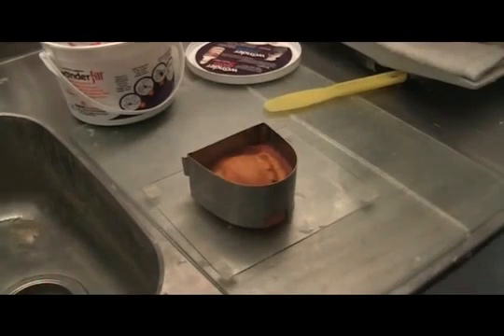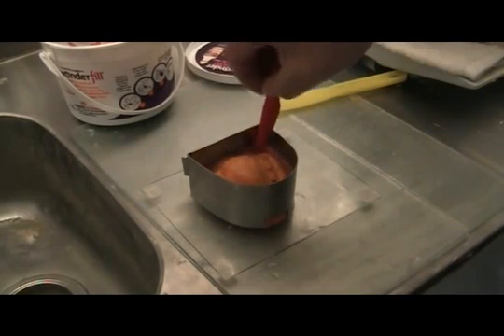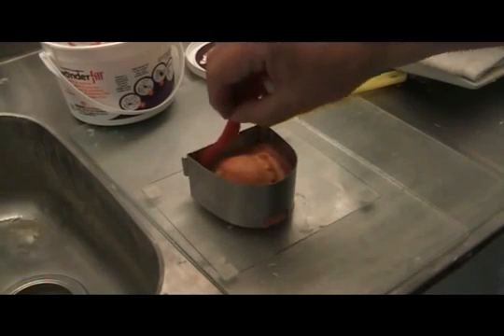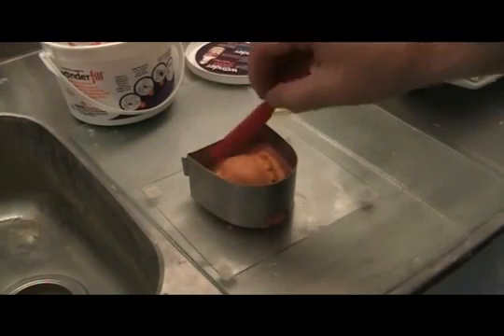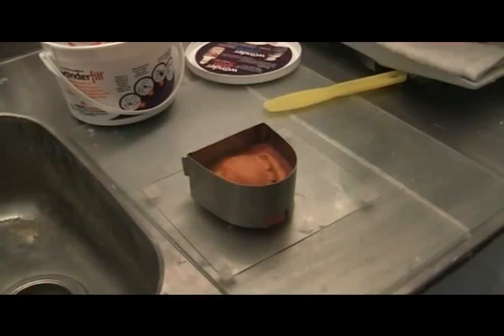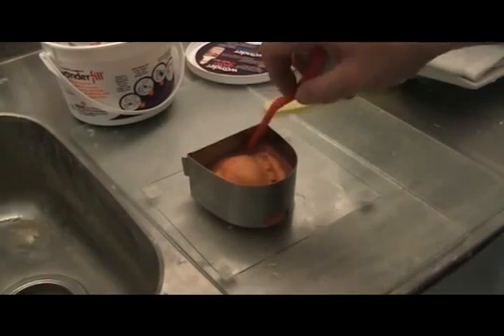This goes along with my article in the Dental Lab Products magazine, talking about how we create higher values in our laboratory and how we can show cost savings while at the same time making a better product. And if you start boxing all of your impressions that come into the laboratory, it just gives you that image that you're very finished, that you have a very quality end product.